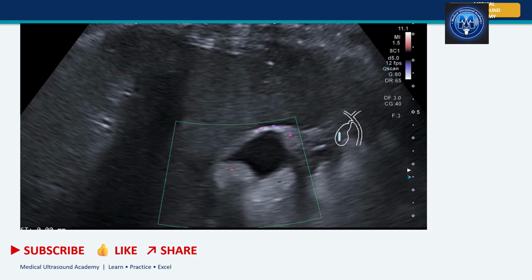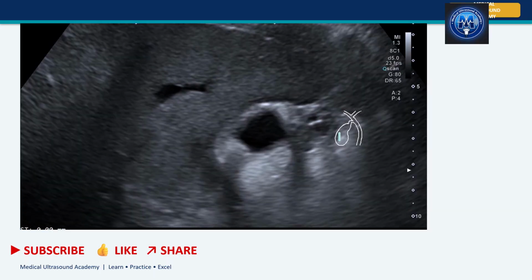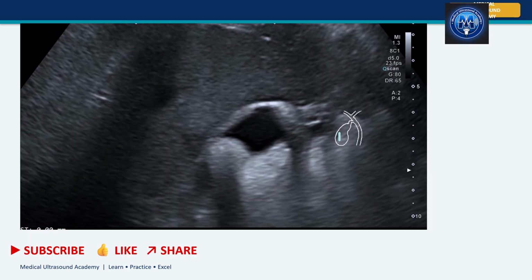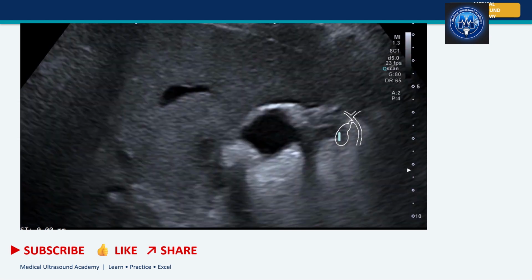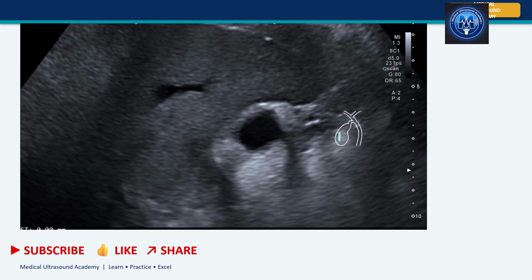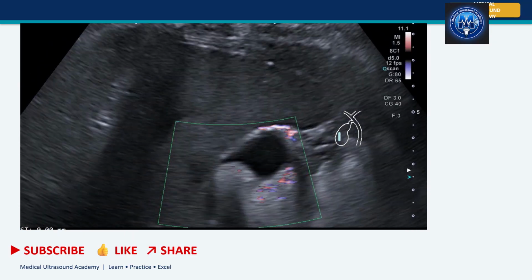When you see this during scanning, don't stop with a single static image. Turn the patient and determine whether the position changes. Regarding the importance of patient positioning, one of the most important techniques when assessing suspected gallstones is repositioning the patient. Start with the patient supine, but if necessary, examine the gallbladder in left lateral decubitus, semi-erect, erect, or oblique positions. If the suspected calculus moves with gravity, this provides additional evidence that it is a stone. Small stones can hide in the gallbladder neck, so careful scanning through the entire gallbladder is essential.